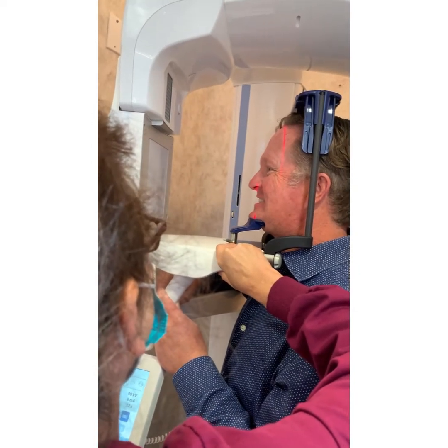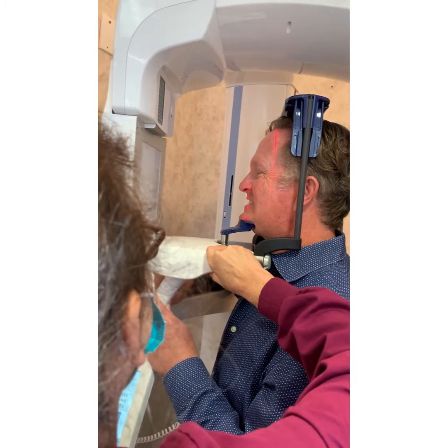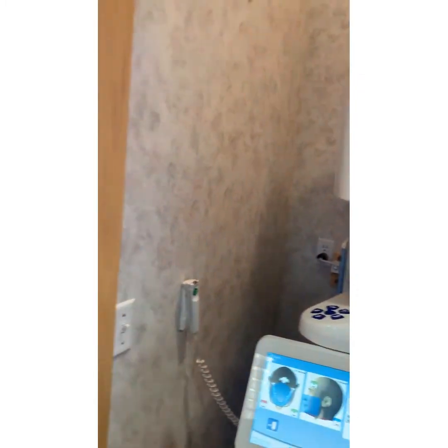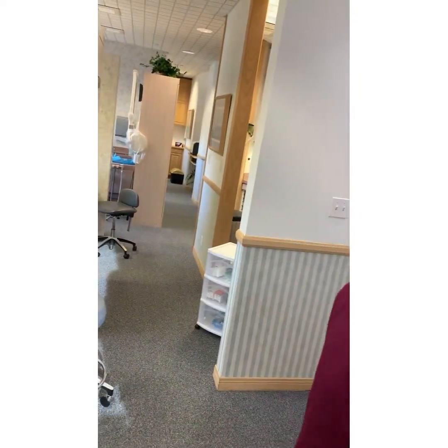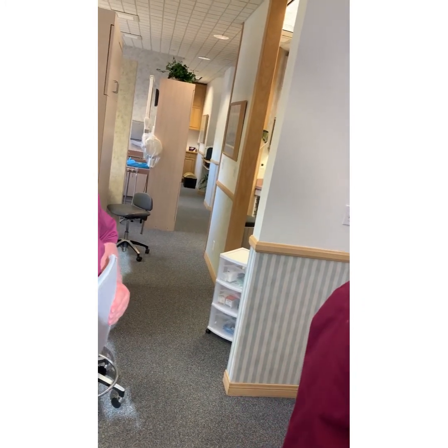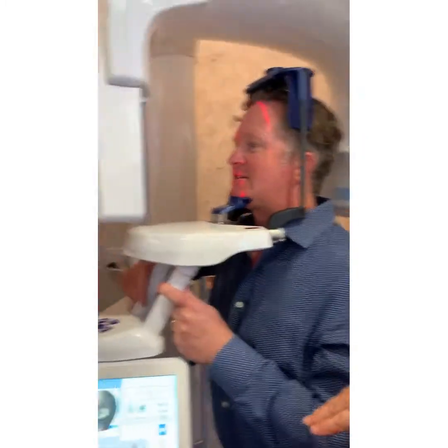Let's see. Almost there. Right there. A little more. Go back even a little more. That's pretty good, right there. Ta-da. Let me take a picture. Okay, so I have to look right here. Because if I go like this, it looks like it's okay. If you're standing there, you're going to see this light right here, which you don't want. You just want this light to be right in front. And it doesn't matter whether it's my lips or my face or anything else.